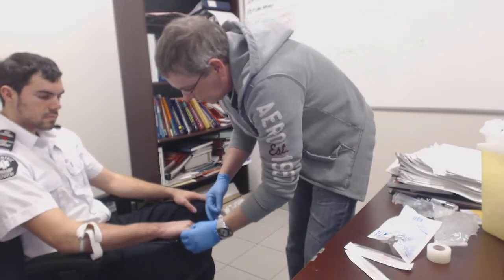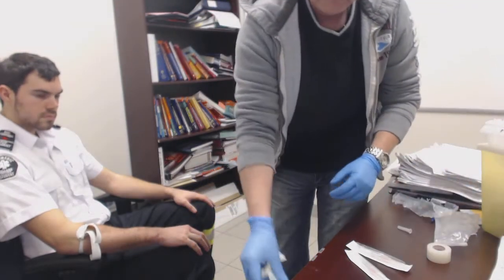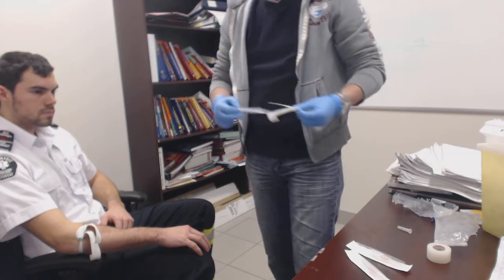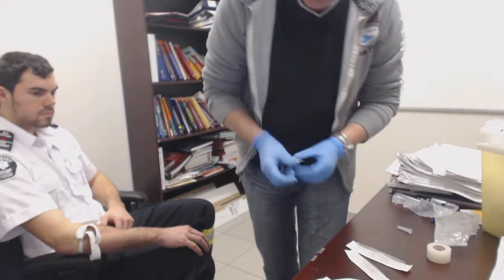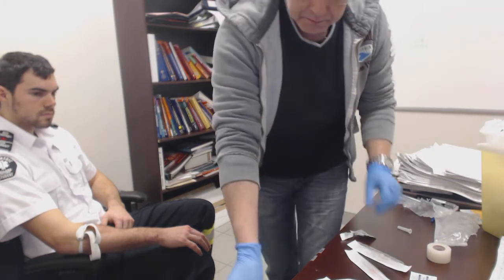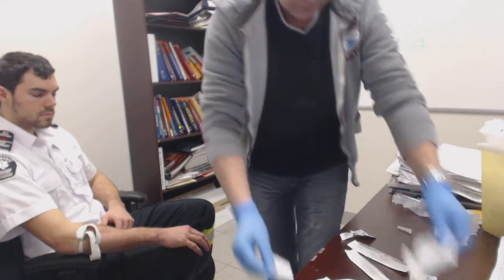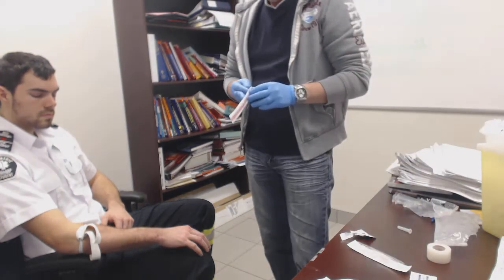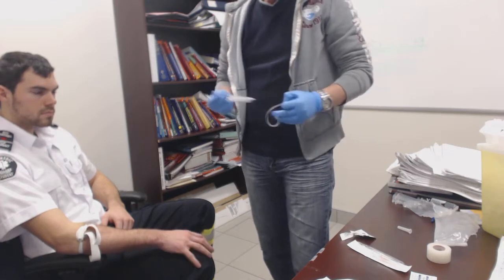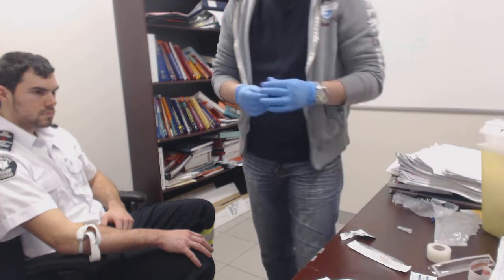Next, I pick my site. I have all my equipment. Open up my Tegaderm. It's best to have all this stuff ready to go so that you're not trying to open it while the patient's sitting there waiting with a Cathlon in his arm. And just for the sake of demonstration, I'm only going to use a 20 gauge IV. If Matt here required fluid, then I'd probably start something a little bit bigger.